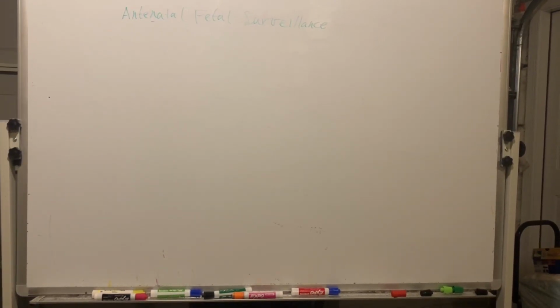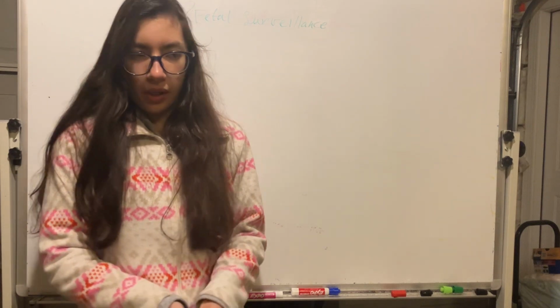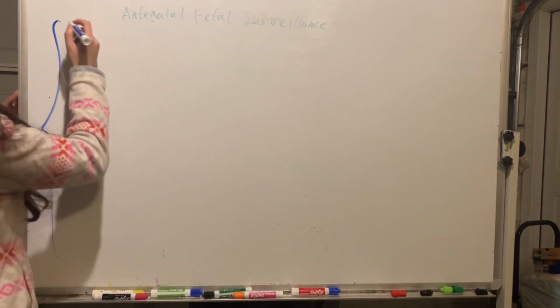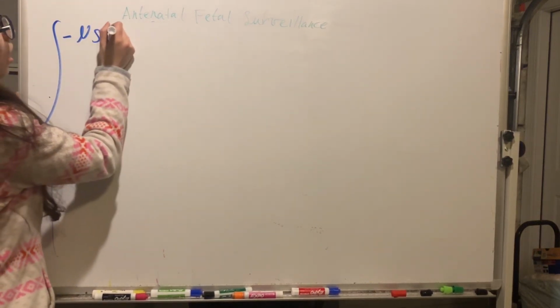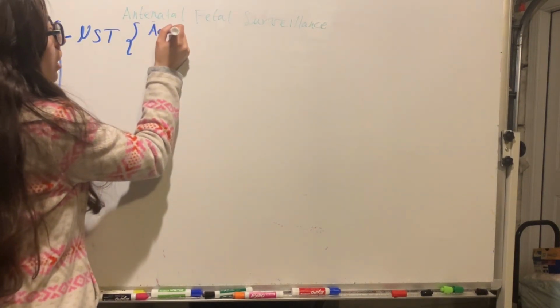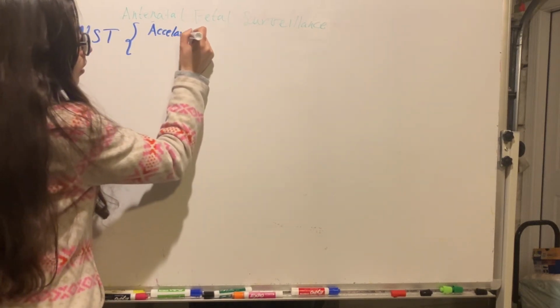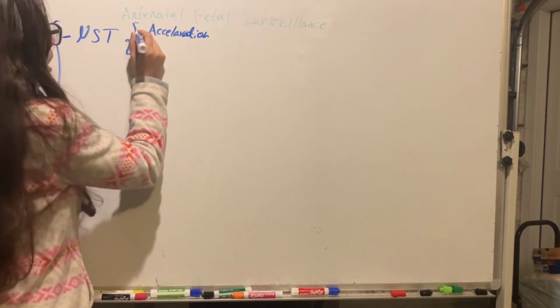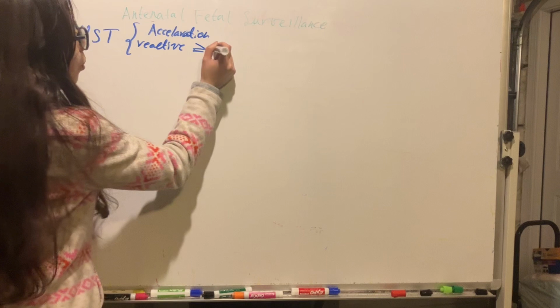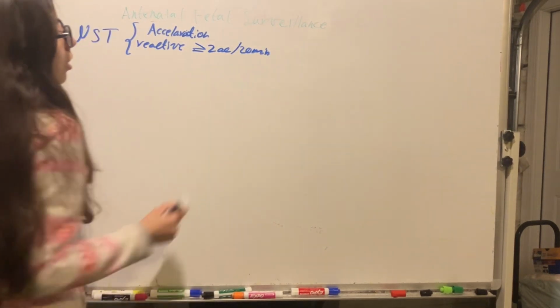Let's review the tests we can use to evaluate for antenatal fetal surveillance. So we can do the non-stress test. Here what we are measuring is the accelerations of the fetal heart, and this is a reactive test if we have 2 or more accelerations in 20 minutes.